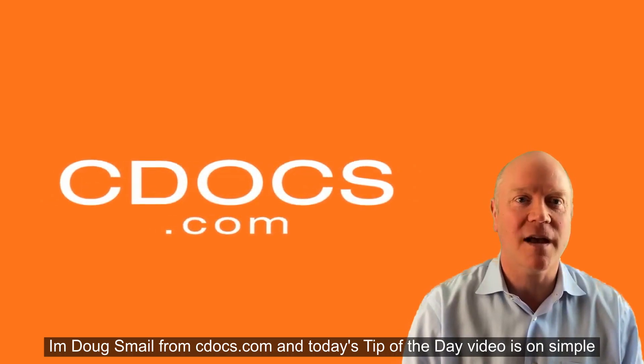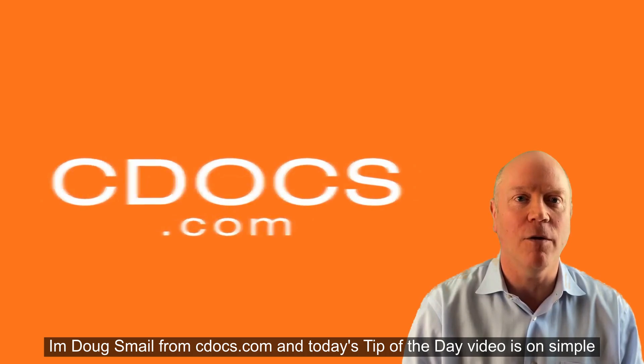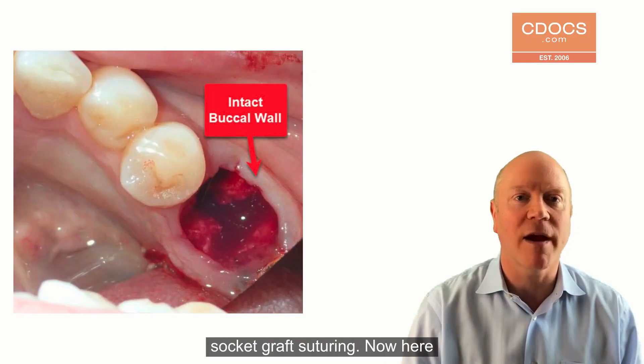Hi, this is Dr. Doug Smale from cdocs.com, and today's tip of the day video is on simple socket graft suturing.